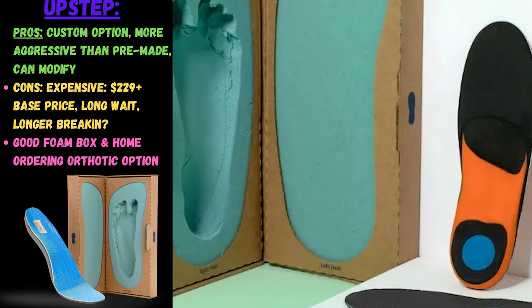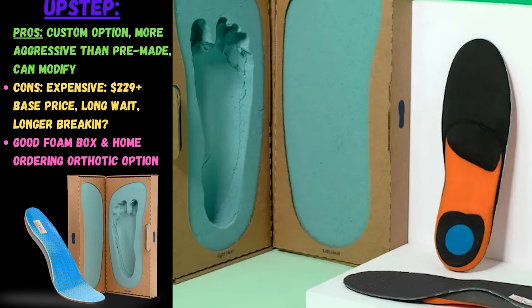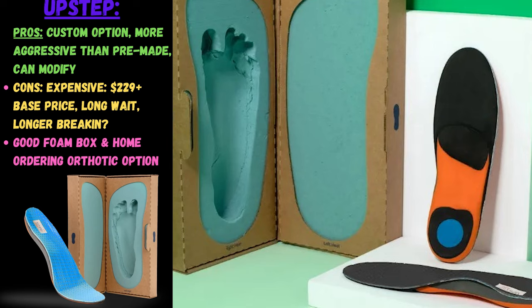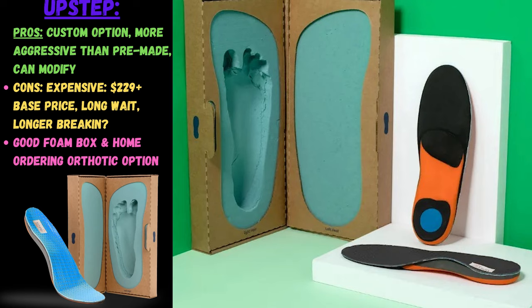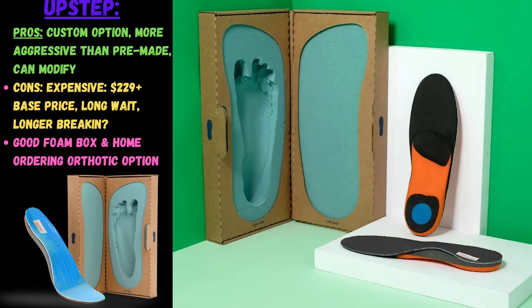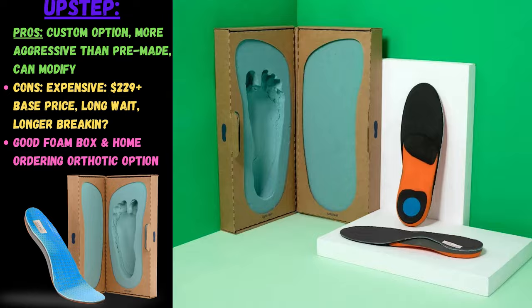Upstep is really popular with its advertising, especially on Twitter and social media. The price is around $230 — a box is shipped to your house, you step in it, send it back, and a few months later you get an orthotic. It's a somewhat more aggressive orthotic than pre-made ones, but still not as aggressive as I would eventually go for. The trick is you're only getting one mold rather than adjustments over time, so it's either a longer break-in period or it's never aggressive enough.